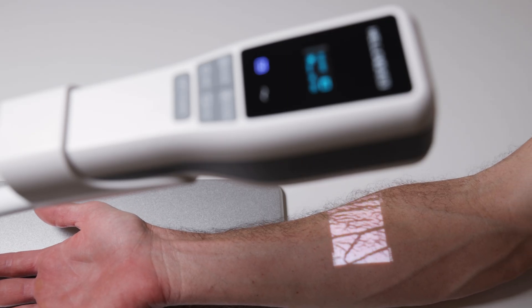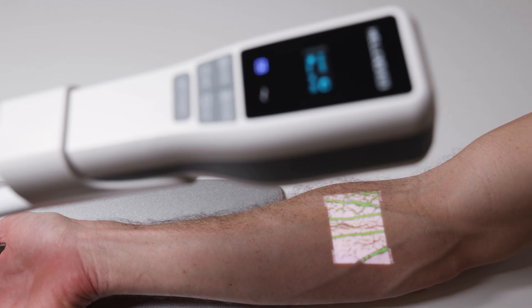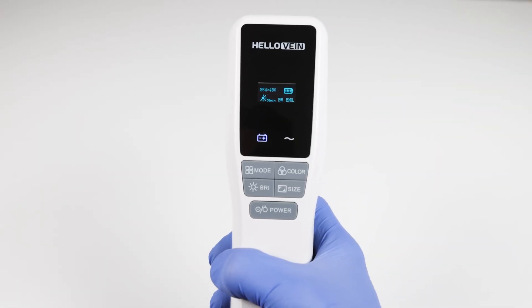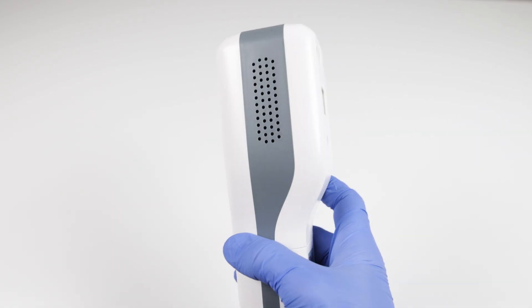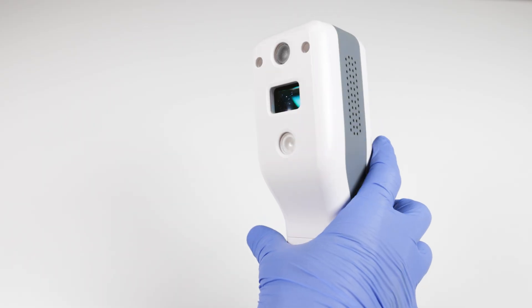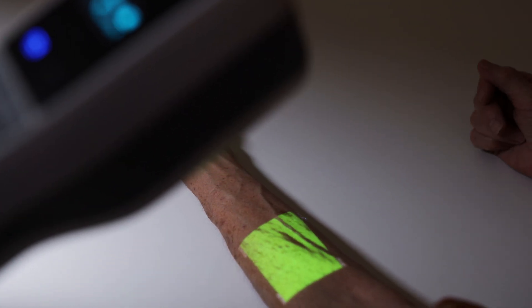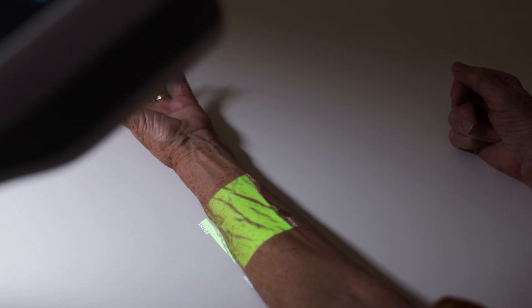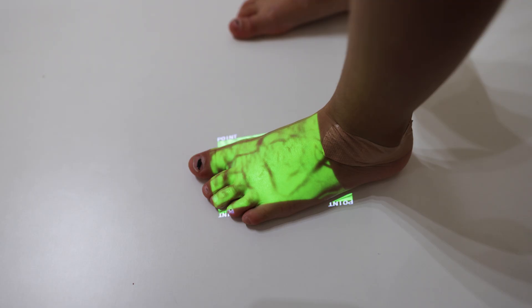The vein finder boasts fast scan technology — under one second without lag or image distortion — to give you a more accurate vein map on the move. The Light 2.0 is easy to operate: the design is intuitive, no calibration is required, and it can be used without advanced training. It's ready to go out of the box and can be used with pediatric and older adult populations across varying skin tones.